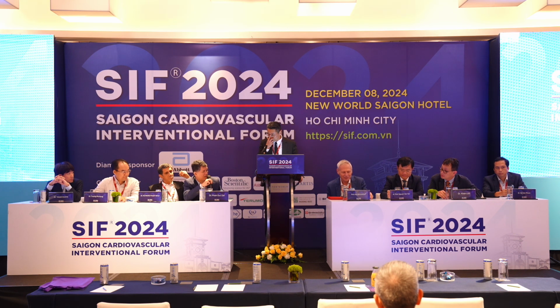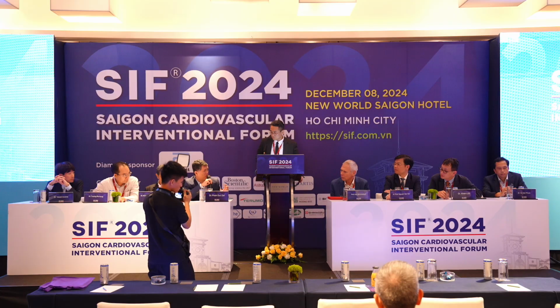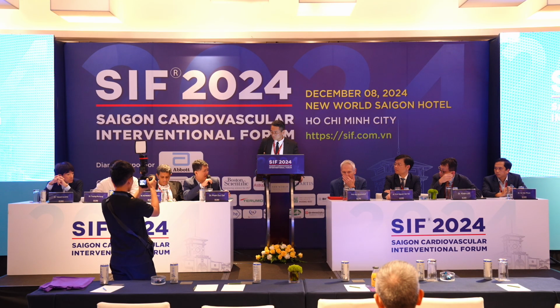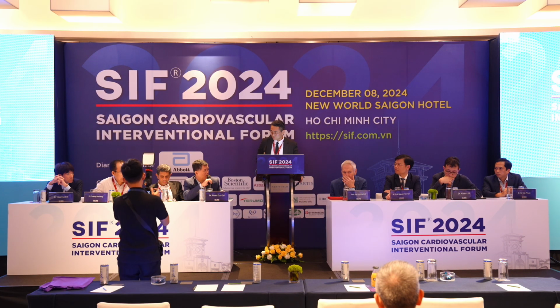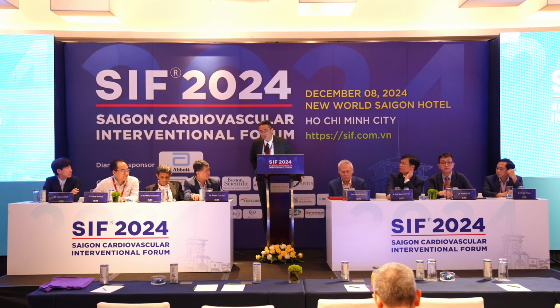I have a last comment. I read data about a doctor from Hungary, they did about 12 cases of rota ablation, but the result was not so good. 50% had MACE, and 25% death of any reason. So in your case, after you rotablated the stent, why didn't you use OCT or IVUS to confirm the result? I don't see the final angiography result, right? Yeah, so with that patient, we just followed up, and the patient is really happy in the OPD. We don't have any follow-up angiography at that time.